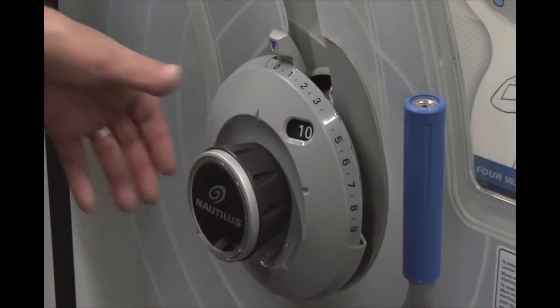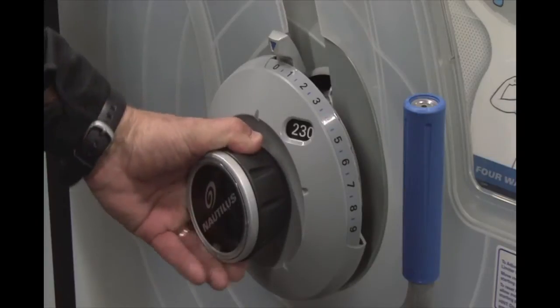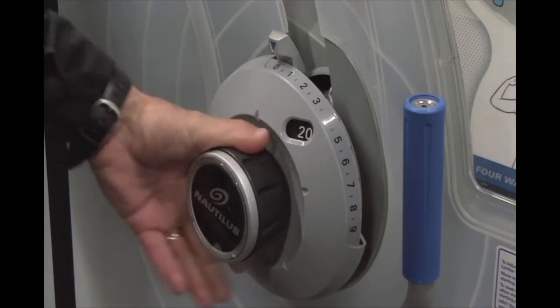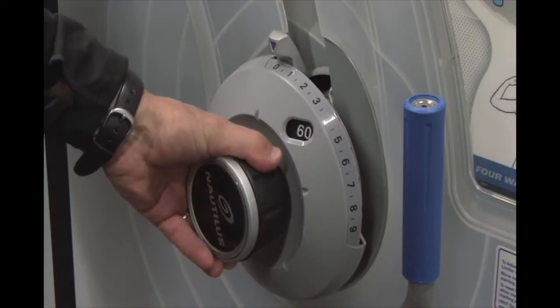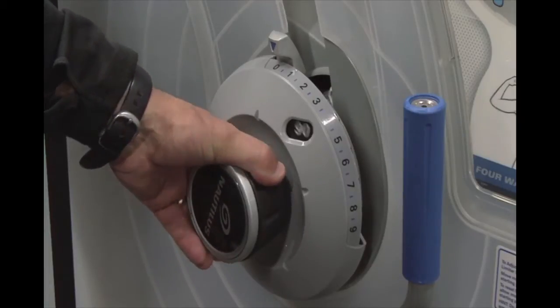Like all Nautilus One products, the Nautilus One Medical features the dial technology, where we can adjust the resistance from the exercise position in 10-pound increments.